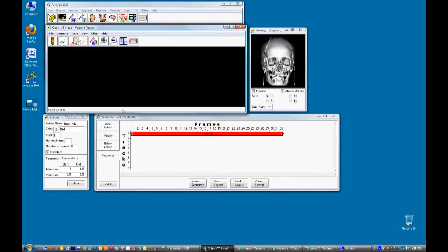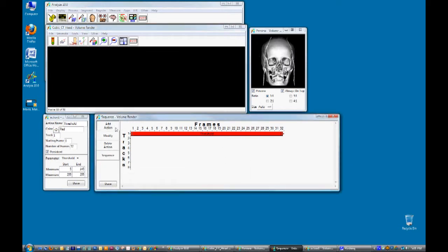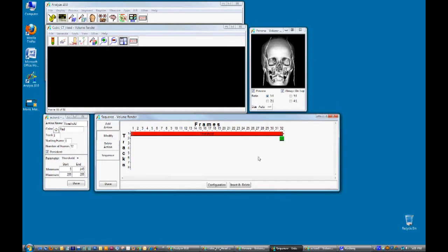To add an action click on the add action button and then click on the sequence tool. Click modify and then click on the new action.